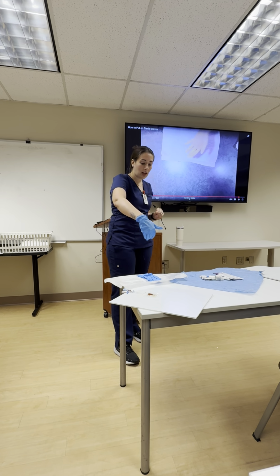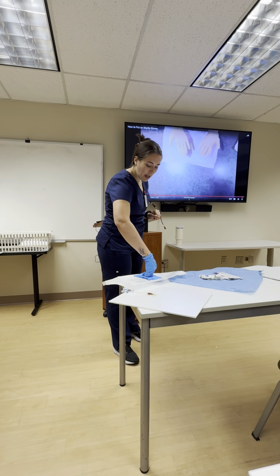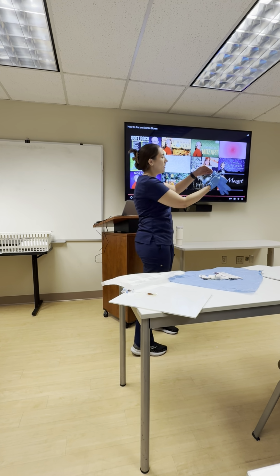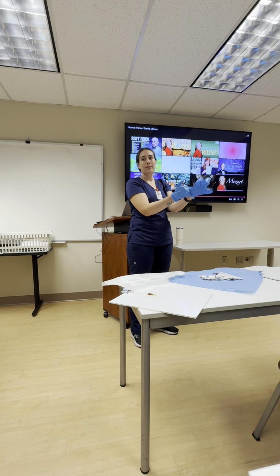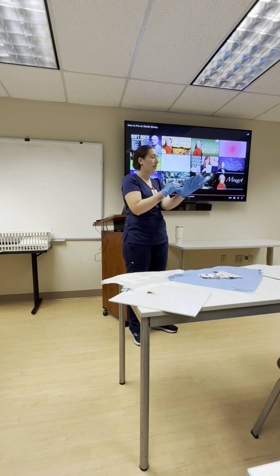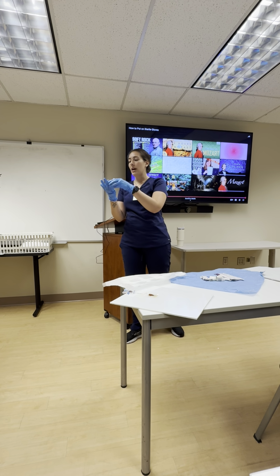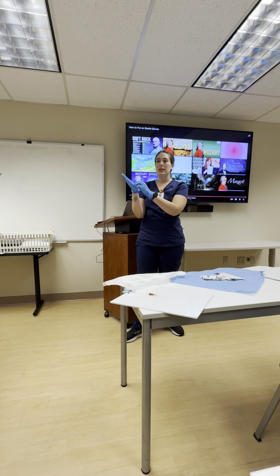Next, you're going to take your second glove and tuck your hand into the flap, kind of like that. And you're going to put your hand into it. And then once you have your gloves on and your fingers aren't in all the way, you can always go back and adjust as needed.